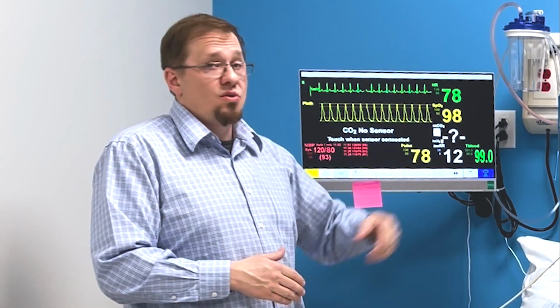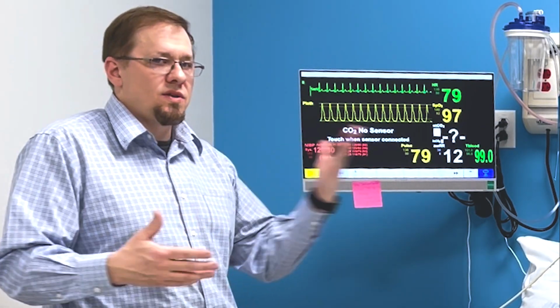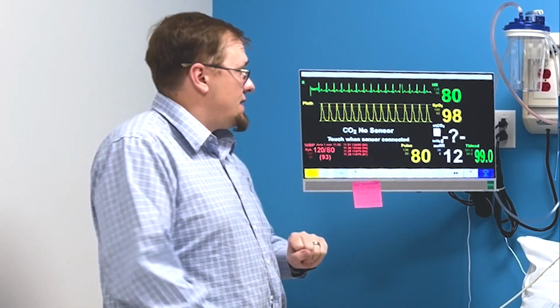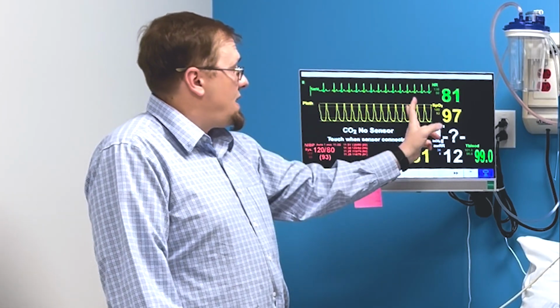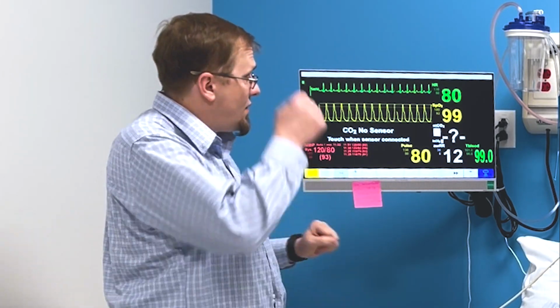And at that point, I always talk about that you may not know all your ECG rhythms, but you know that's normal, and outside of that is abnormal. And you might want to do something about that. So you need to realize what is normal, what is not normal. You don't need to be that expert yet, unless they do, and then ECGs are on them. You have a heart rate that will hopefully correlate with the pulse we feel. We have a pulse ox waveform that does most clinicians no good, but they have that pulse ox number they're looking for.